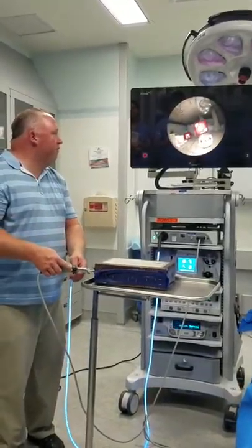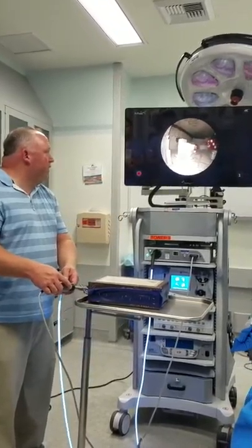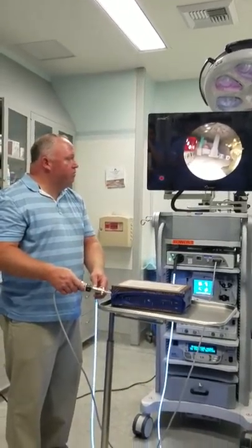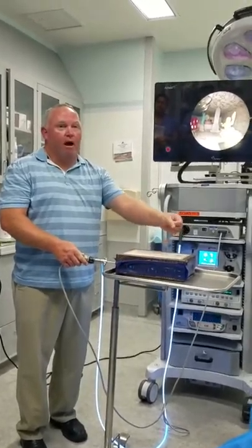That kind of stuff. Dice. Find the five. Find the three. You know, that kind of stuff. So what I ask you to do, and then what we'll do on Monday is we're going to work together. So someone has the scope, and then I have other instruments where you can grab things and move things.